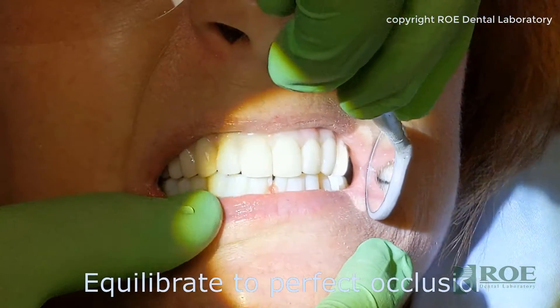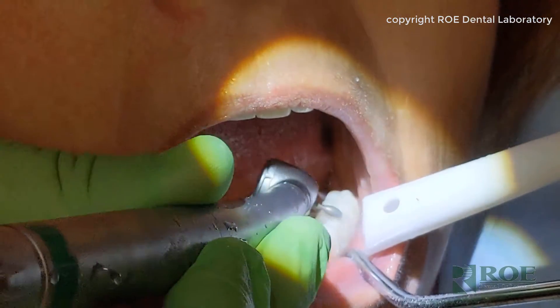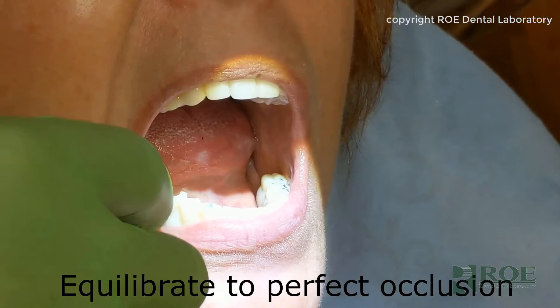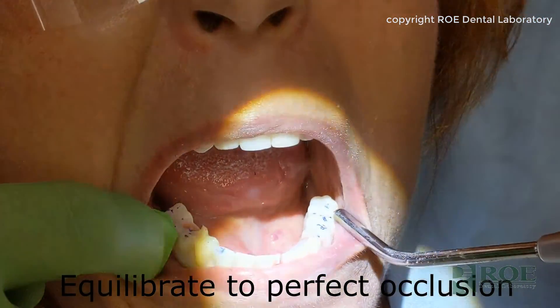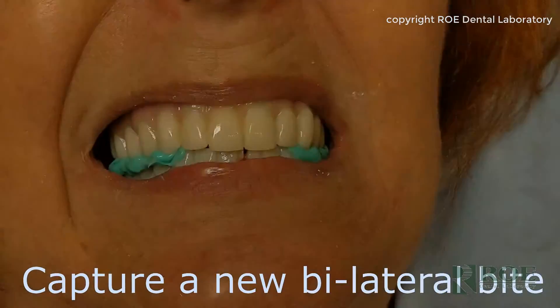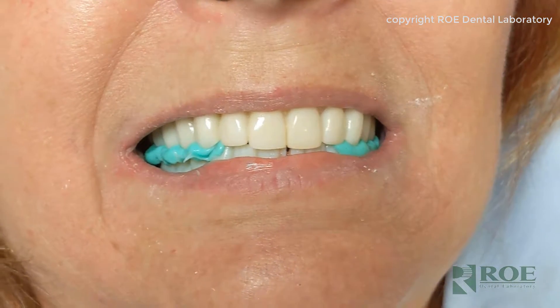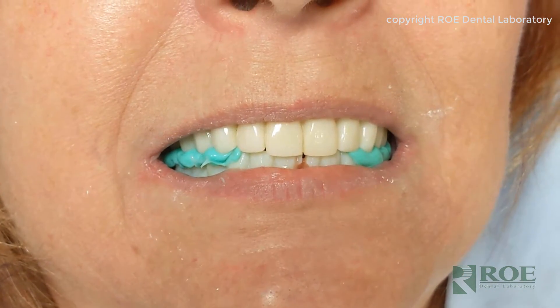Bite down. Hold. We always recommend taking two bites like this, and then when you're visually looking at the teeth, you see the uppers and lowers come together. Too often it's a full arch bite covering all the teeth — you can't see how they come together.